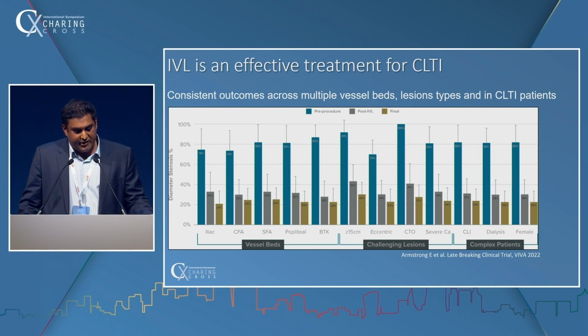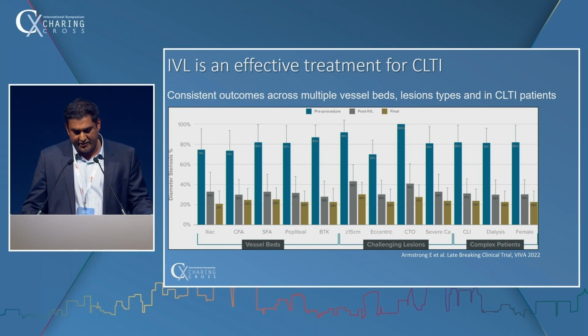So just to conclude, my final 2 slides: the key message here is that IVL is consistent across multiple vessel beds, and our patients have multi-level disease. It's consistent across CLI patients, eccentric lesions, and patients on dialysis as well.